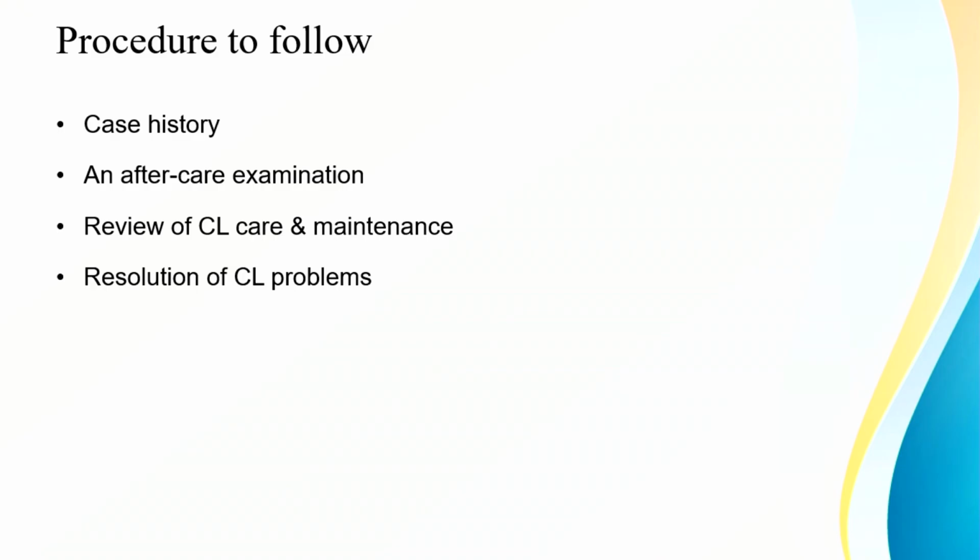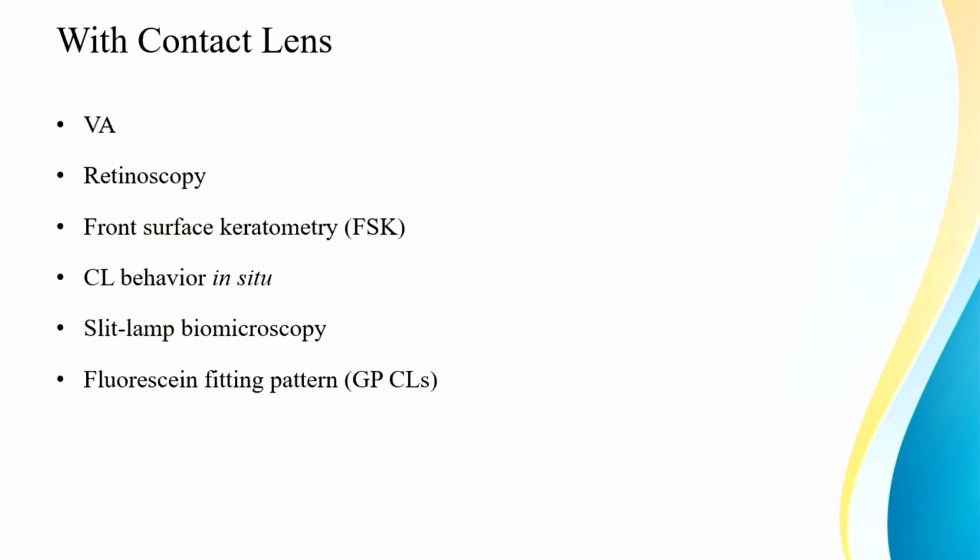And in case of RGPs, we just check whether the RGP is popping out, whether it's displacing, how comfortable the patient is with the lens, whether they sleep with the lens, whether they just wash the face with the lens. All these are included in the aftercare procedure. So with contact lens, what all do we do? We can classify it as with contact lens and without contact lens.